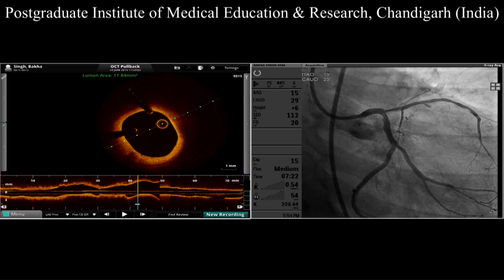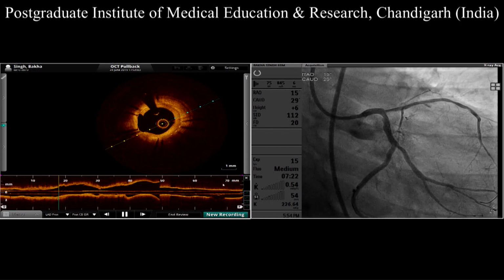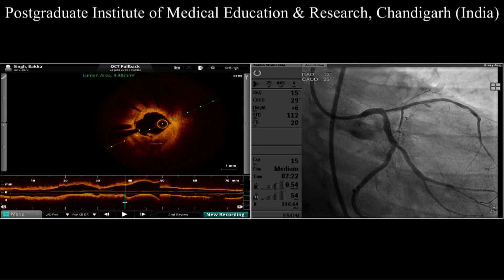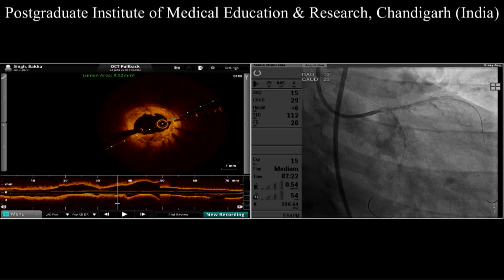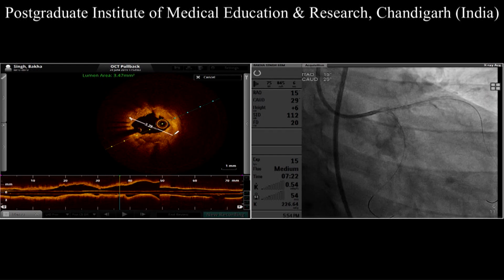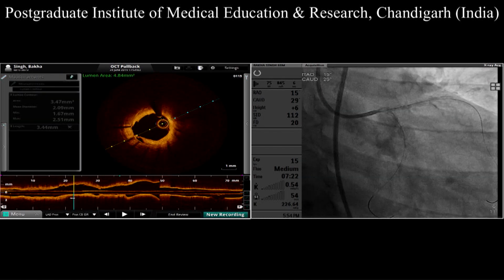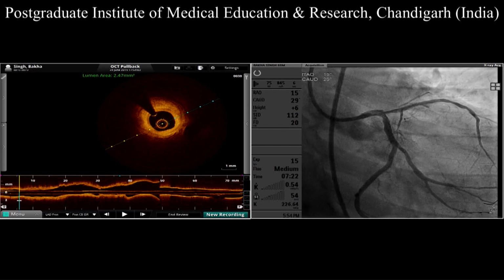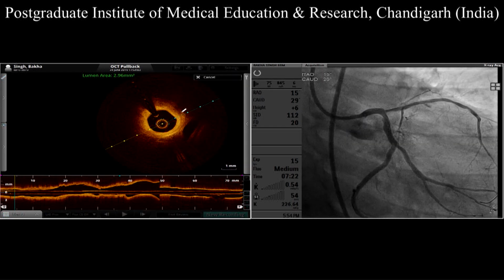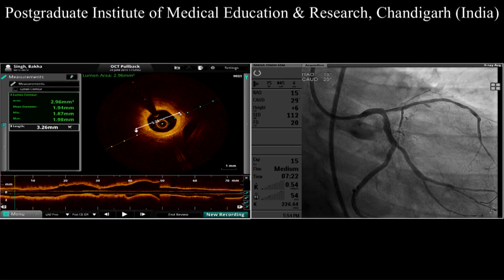Okay. Fine. And what's the size? Size is coming how much? Approximately over here, yeah. Okay, so any comment about over here, to go ahead for, say, drug-eluting balloon or drug-eluting stent, and in case it is drug-eluting, which one?